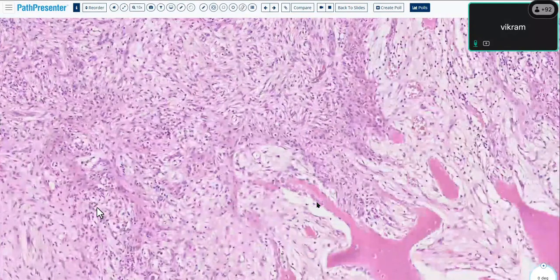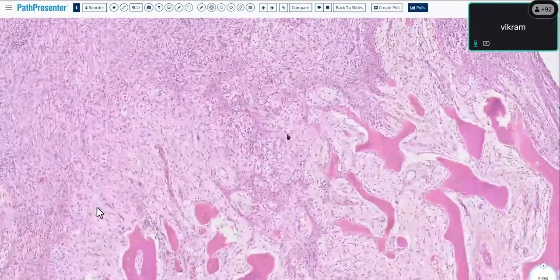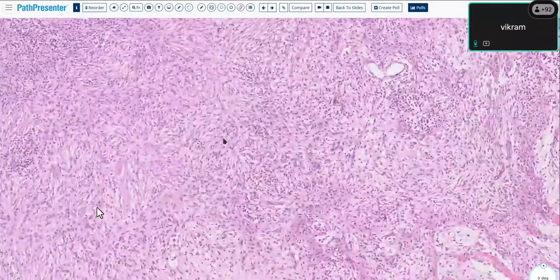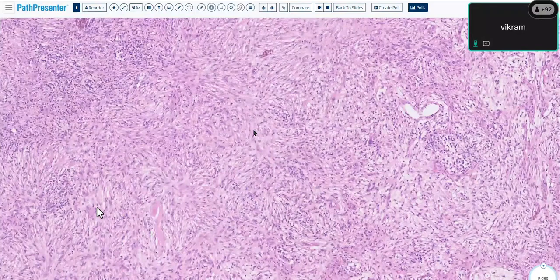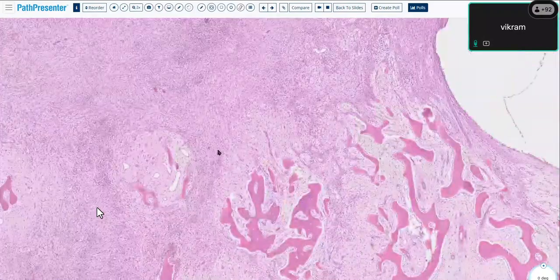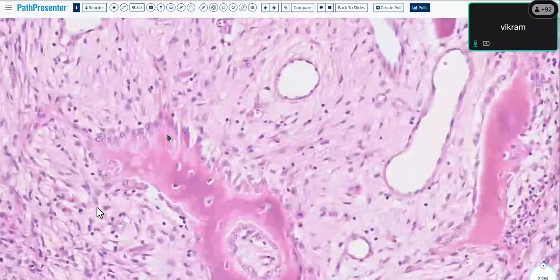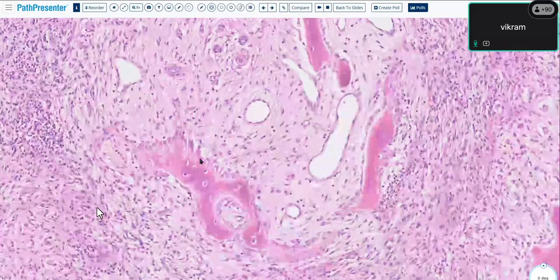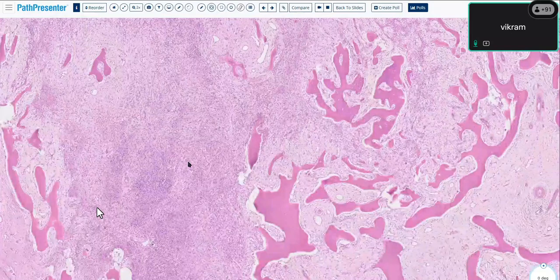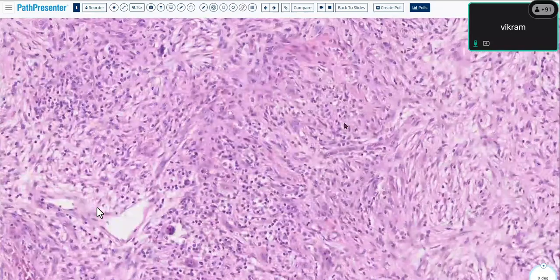Again, on the biopsy itself, you may be lucky to see a little bit of zonation. This is the most immature area. This is actually a beautiful storiform type pattern. There's cysts here as well. I heard somebody mention the word cyst. You can see very nice osteoblastic rimming here, right? That means that it's probably not an osteosarcoma. And as you march outside, it's still quite cellular here, right? But some of the cellularity is driven by inflammatory cells. There are scattered osteoclast-type giant cells.